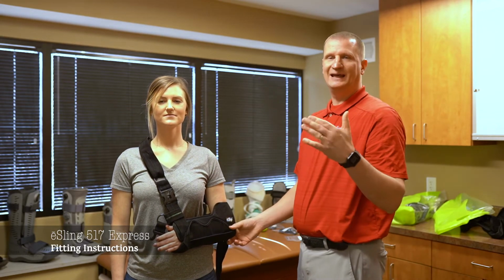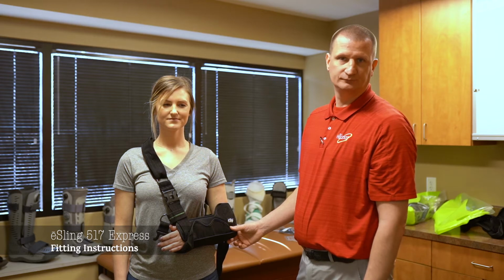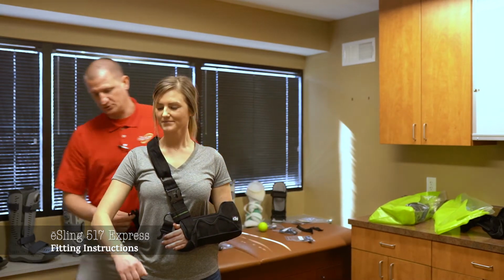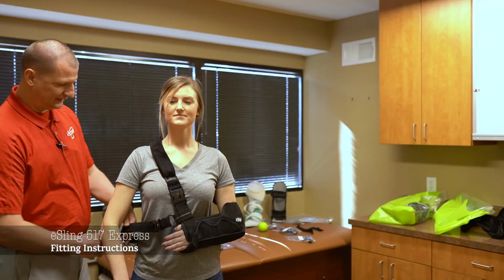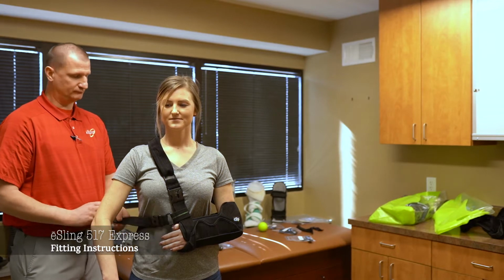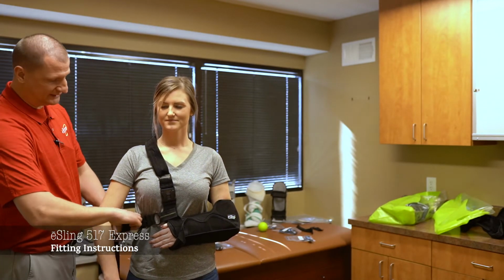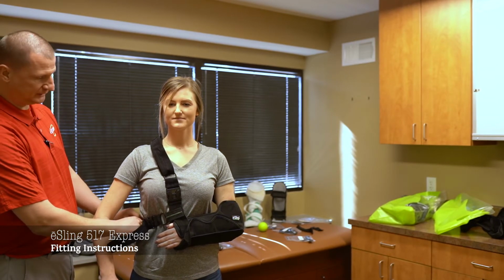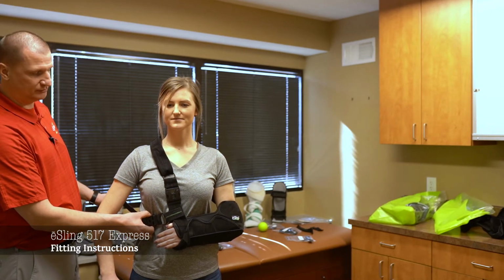We want the patient's hand to be free for any type of use, for any type of exercises. After this, we can utilize the waist strap. So this will just come around the patient's body. Again, this is able to be cut in the front and the back. We're going to want to keep this strap to her side for basic adjustments. And also it has a pinch release tab here for her to get in and out of.